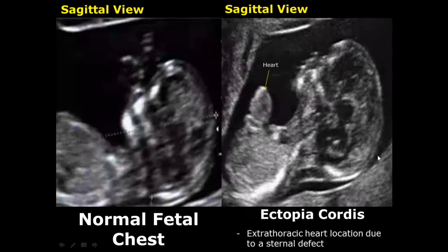Ectopia cordis refers to the extra-thoracic location of the heart. The heart will be outside the thoracic cavity because of a sternal defect. Here you can see in this sagittal view, the heart is located outside the chest.